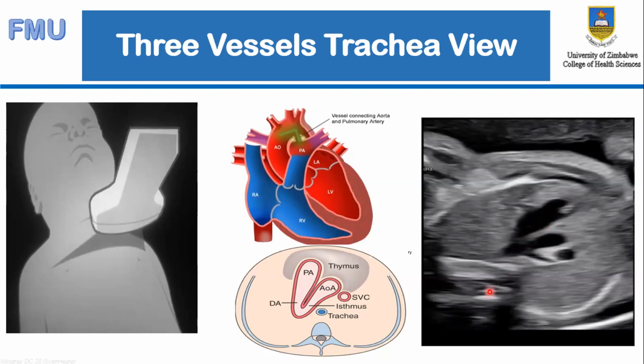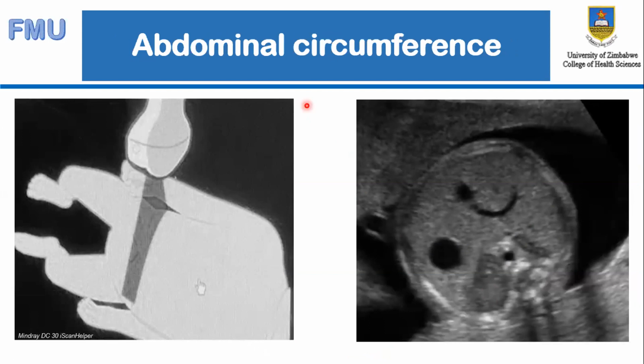Then moving on from the heart, we go on to the circumference.